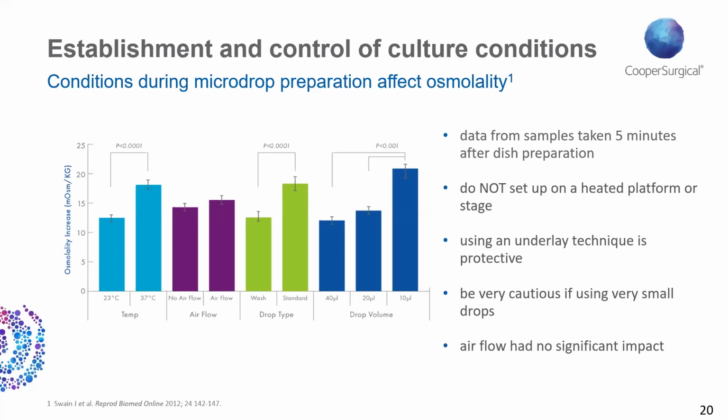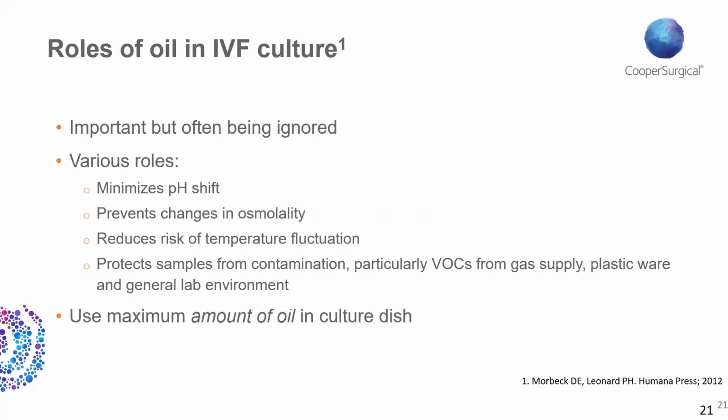So volume is important, not only of the culture medium that you're going to add to your dish, but also of the oil. And we're going to go on and talk about oil in the next slide. So don't overlook oil.